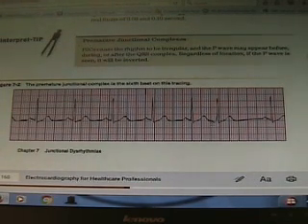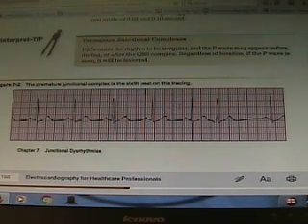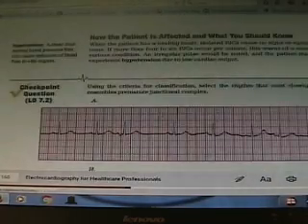Now, where's the P? It's missing, isn't it? The P is getting gobbled up by that last T wave. And that's how you know it's a PJC. When you were looking at the PACs, the P wave was there. It's just smushed up. Nothing's smushed here. And this looks way more regular than a PAC. So a PJC, you know it's a junctional problem, hence the J. And what's missing? P wave. And it's only slightly irregular. Okay, so that's the best way to look at it.